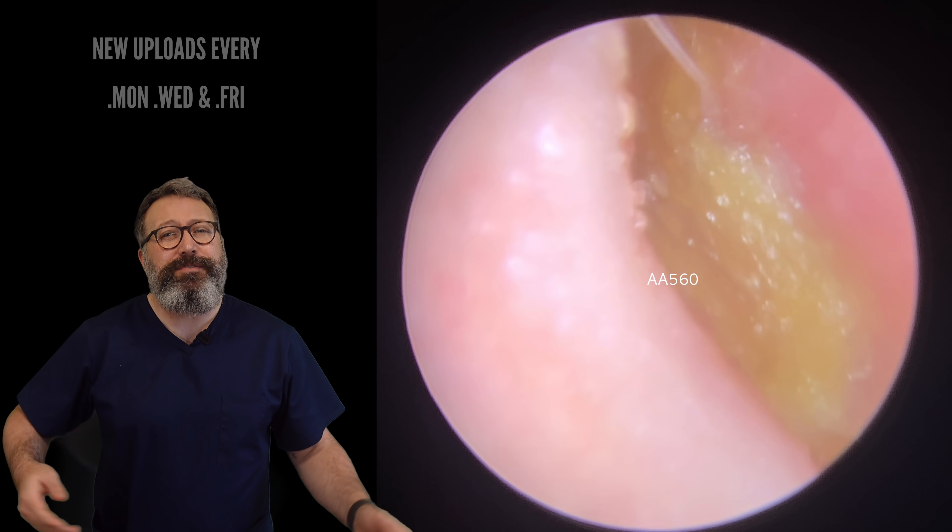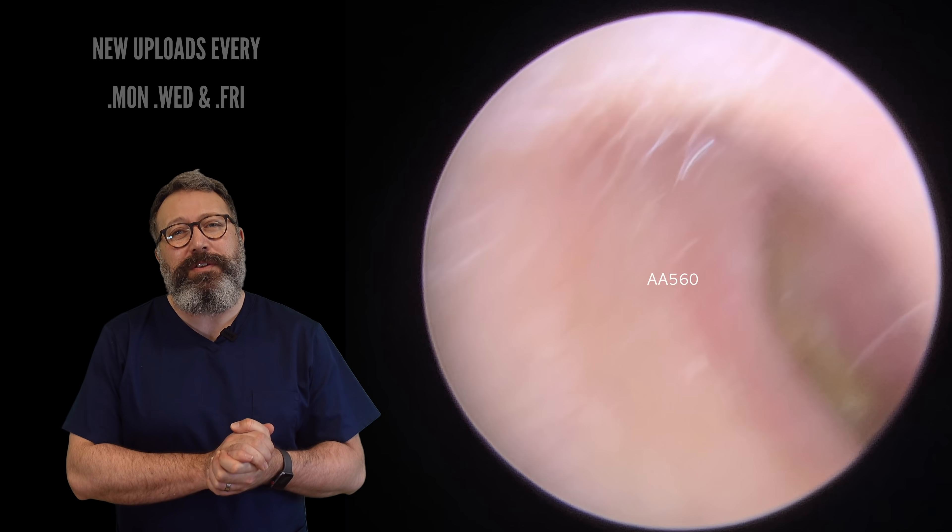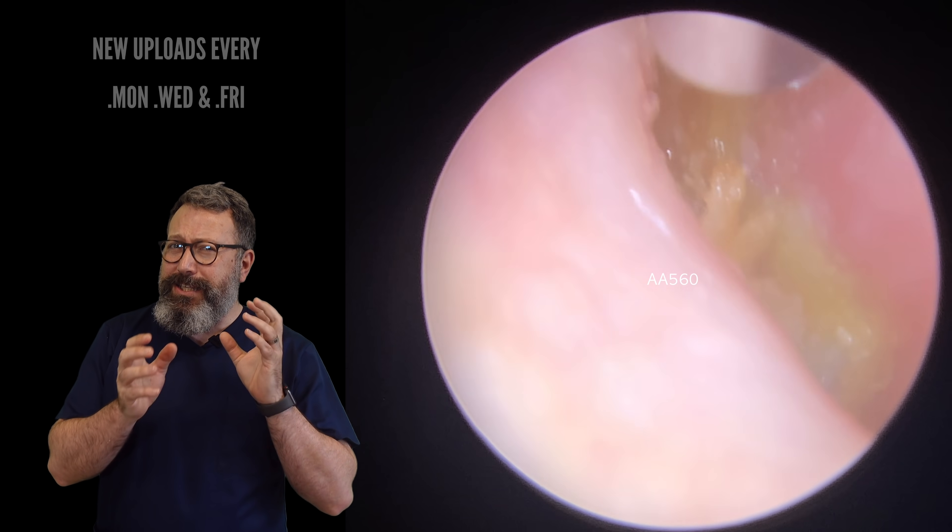Hi everybody, this is Reece Barber from Audiology Associates. Thanks very much for watching our earwax removal video. Well, not technically true — this is a skin removal video.